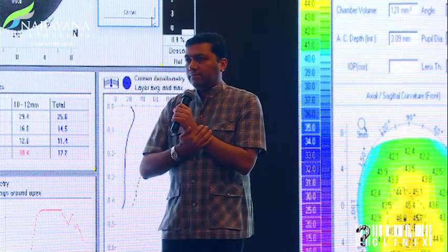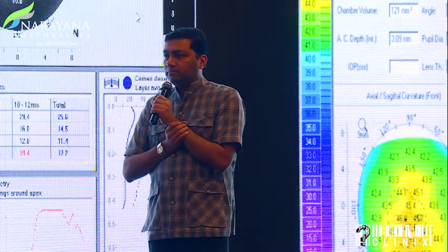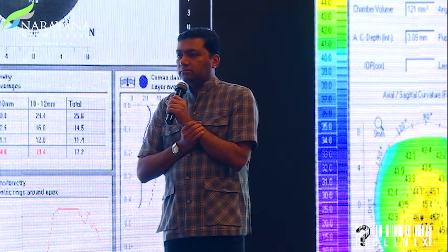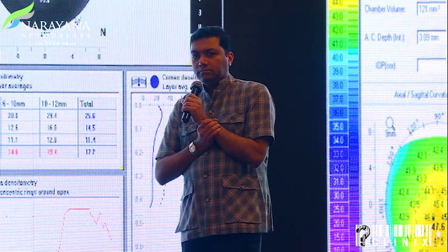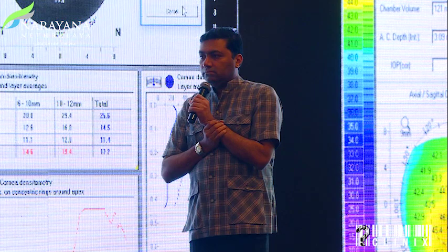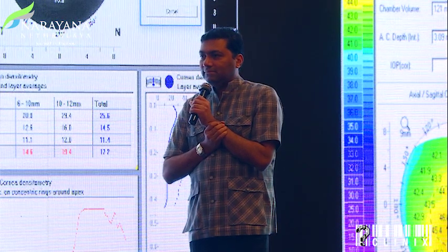So this is very important here because... I'm sorry, I completely agree with that on an individual patient basis, but I think you'd agree that on average, I've never been accused of being too quiet, sorry. On average, with effective protocols, if you look at 30 patients, 50 patients, there is flattening.